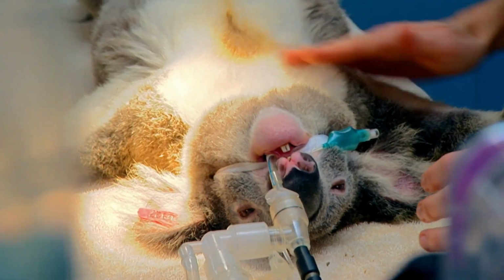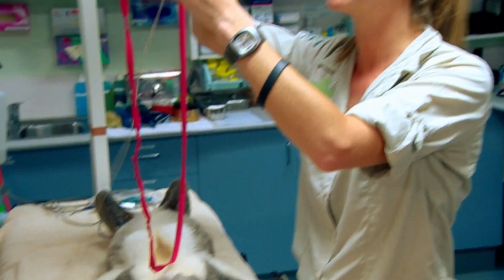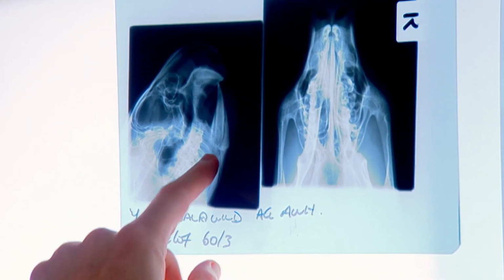Yoda's a fighter. He's become a popular little koala. He's a special koala too, because it was looking very touch and go when I first saw the fracture. Everyone's got their fingers crossed Yoda's X-rays are going to be good. This was the initial X-ray that we took the day that he came in. Then we've taken progressive X-rays since then just to see how it's healing. He's eating very, very well, so we weren't really concerned about it being unstable at all. We just wanted to check its progress and make sure there was no infection starting up.